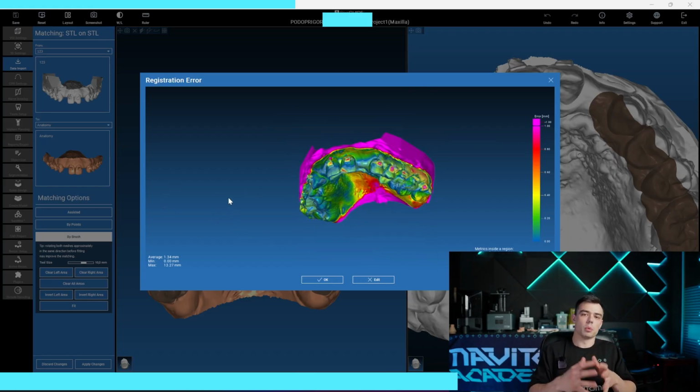If you have ever worked with silicone impressions, you know that when you mix the components of the silicone impressions, they become very solid, very hard, and that's actually the main advantage of silicone impression, that they are mixing all together. Chemical reaction goes on, and the silicone impression becomes solid and keeps the shape of the teeth and so on.